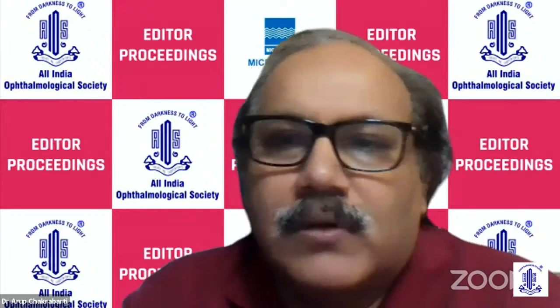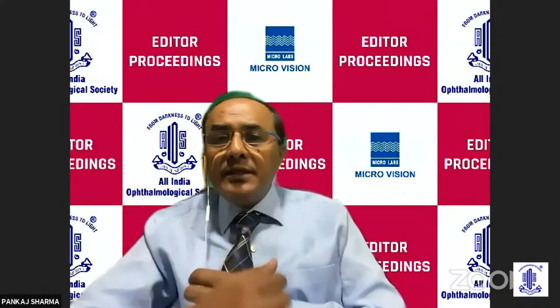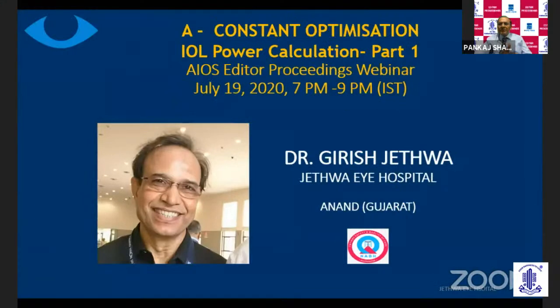And any questions for Dr. Ramesh? Yes, I have one quick question for Dr. Ramesh. The ELP calculated is usually on the basis of the anterior chamber depth, and different instruments calculate the anterior chamber depth differently. One is from the anterior surface of the cornea to the anterior surface of the lens. One is from the back of the endothelium, that is the true aqueous depth. And since after refractive surgery, the thickness of cornea also changes, which one would you suggest would be the best to have the ELP power out of all these?